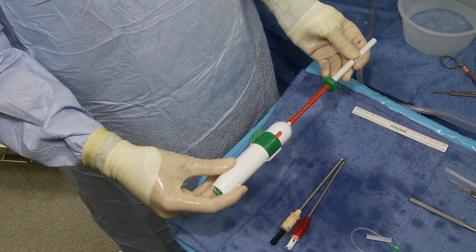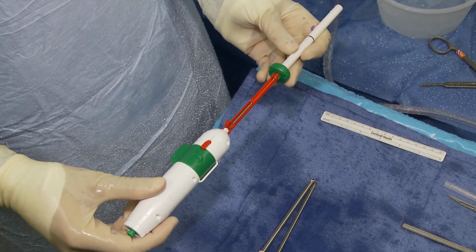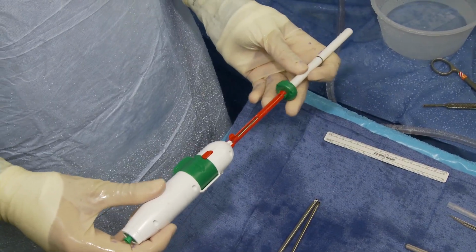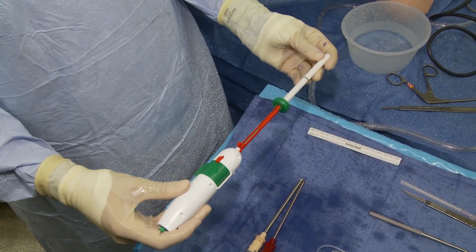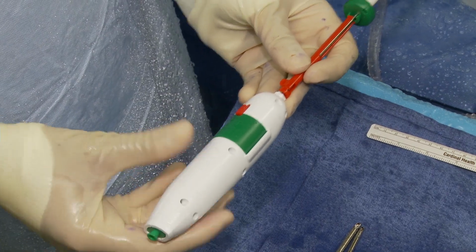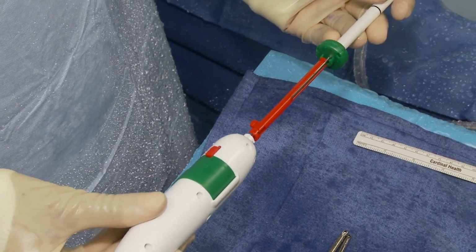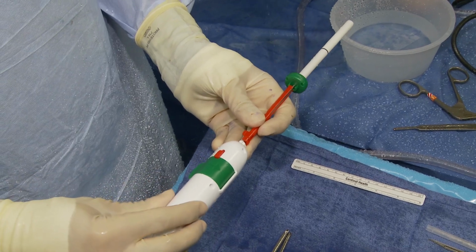We've now measured, and we're going to use a large implant. As we mentioned in the introduction piece, the implant comes loaded on a deployer. Once you open the package, the entire construct is already assembled and sterile and ready for use. So there's a couple of different portions of the implant that you should be familiar with, including the insertion tool. This is the insertion handle.